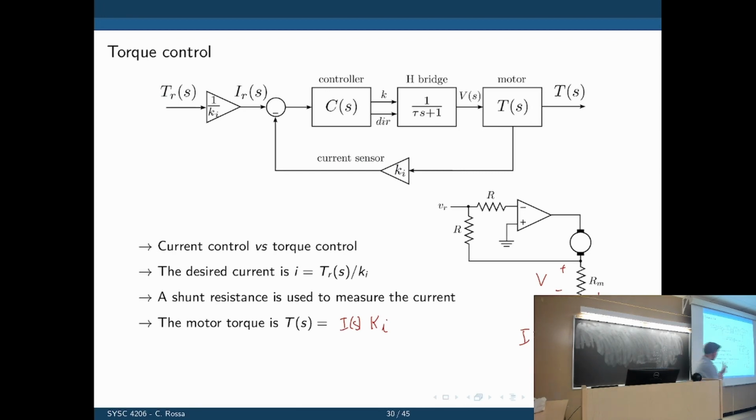All right. So for every motor, we need one of these. If you have 6 motors, you have 6 times that. That's why these haptic devices can become very expensive, because control has to be really, really precise.